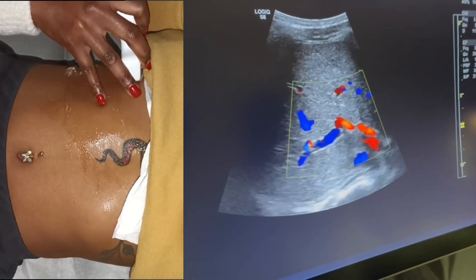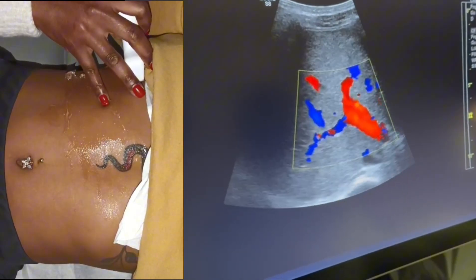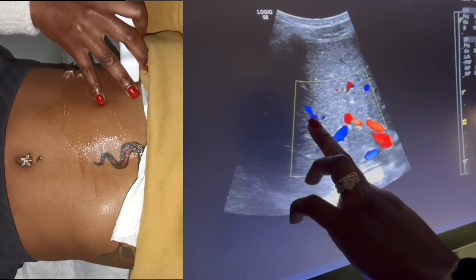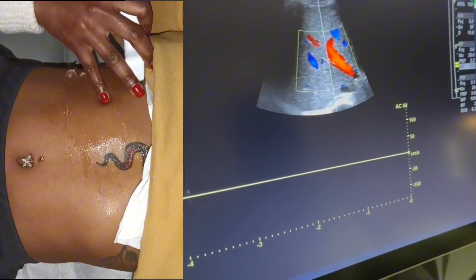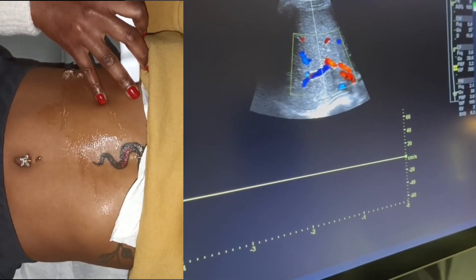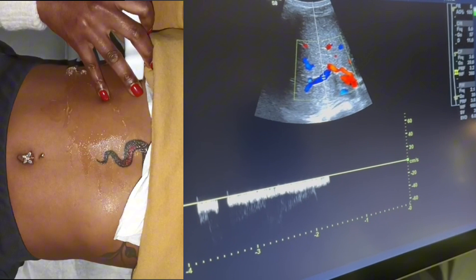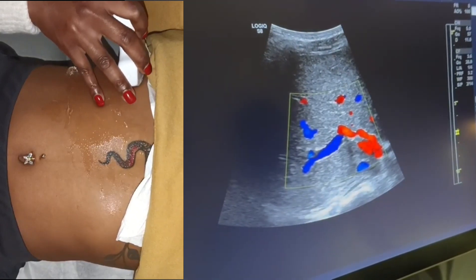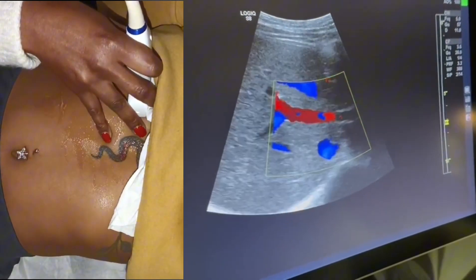I can see the right portal vein. As the right portal vein comes down, you can see it's a negative Doppler shift. That right portal vein further splits into the right posterior portal vein and the right anterior portal vein. I'm going to Doppler the right portal vein — it will be a negative Doppler shift because of the way it dives down. That's the right portal vein. I'm also going to try to get a left portal vein.